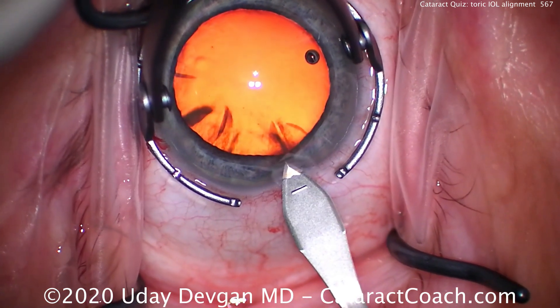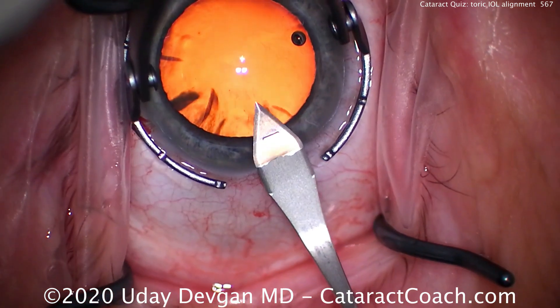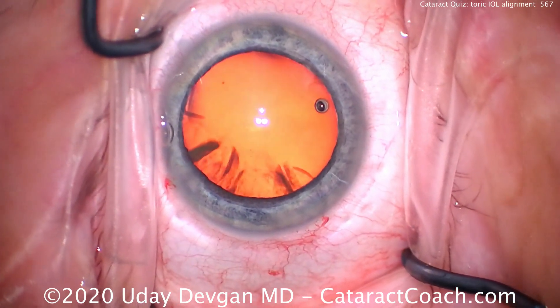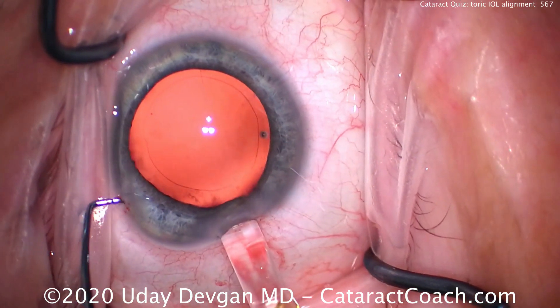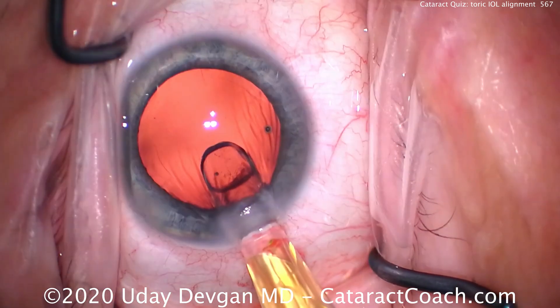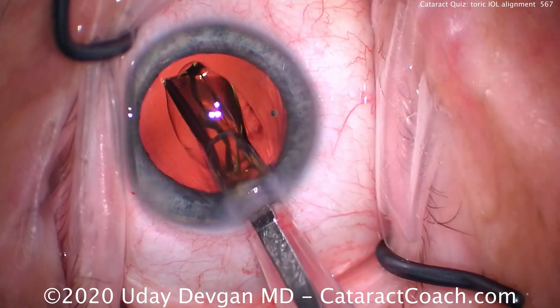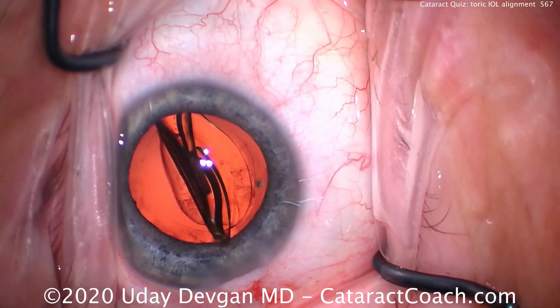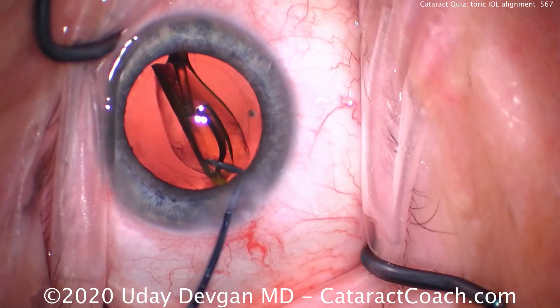This incision is being made at 30 degrees, so that's on the flat axis, and that's going to increase the total astigmatism by about 0.3 diopters. We'll incorporate that change into the toric lens power and so we'll still achieve our desired outcome. Here comes the IOL going into the capsular bag.